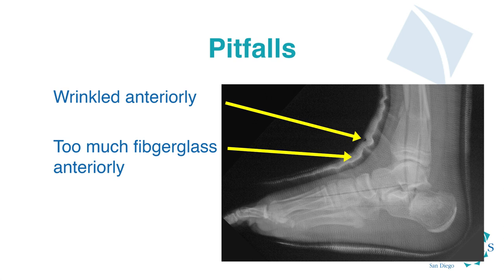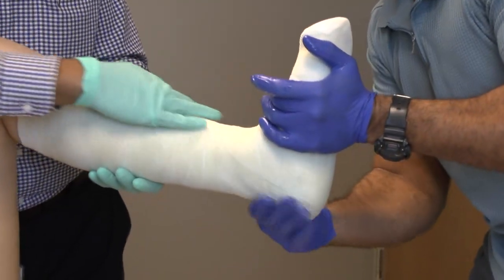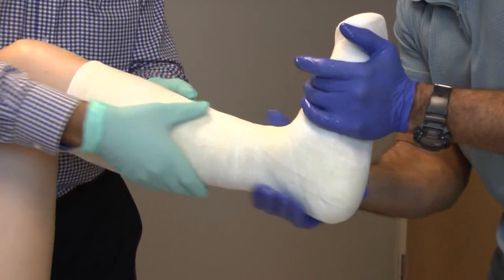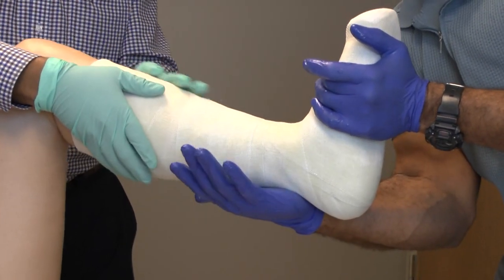If you have not wrinkled the cast and have maintained position throughout, you can now apply the appropriate molds. In this image you can see the difference between no mold on the heel, a minimal mold, and a good mold. The good mold contours with the Achilles tendon and wraps around the heel of the foot, minimizing the risk of ulceration that you would see with a no-mold cast. Use the palms of your hands to make these molds, keep the foot in a good position, and create no wrinkles.